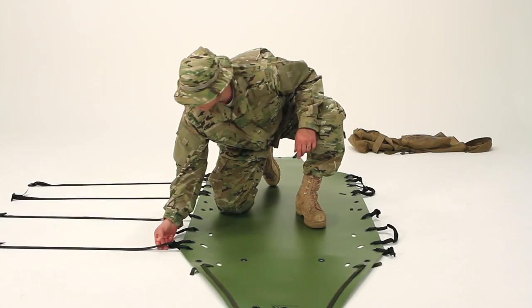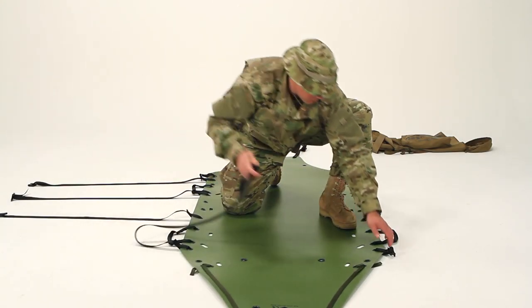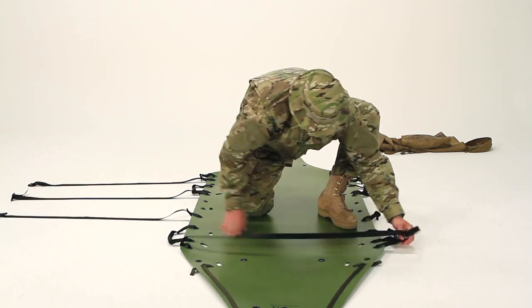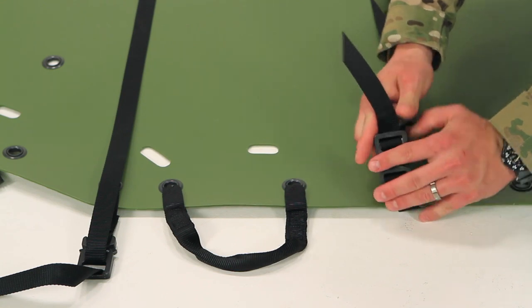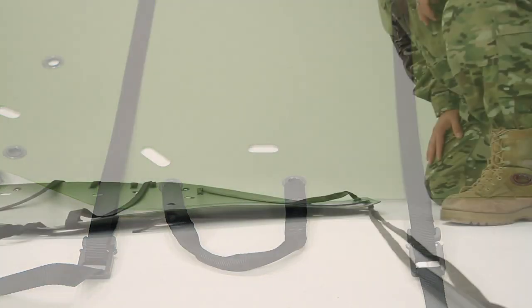It's easy to repack the Sked. Begin by buckling the straps and laying them outside the perimeter of the Sked. Make sure the straps are laid out flat so it'll be easy to tighten them the next time you use the Sked.